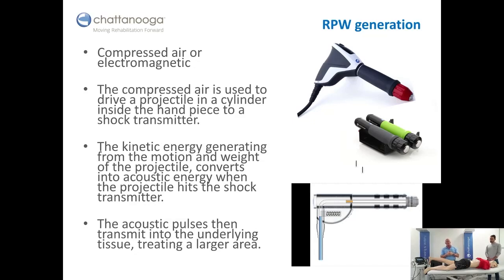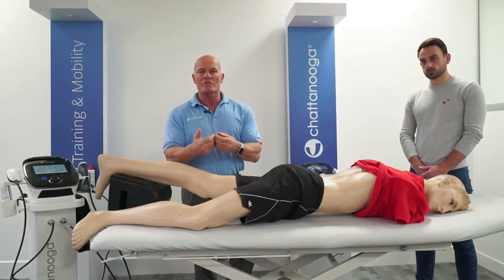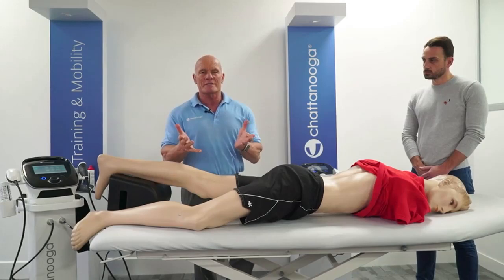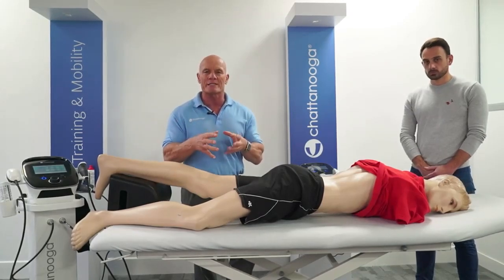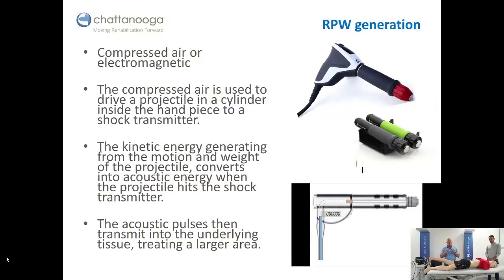And I've also contacted the manufacturers because I wanted to know what the energy value is that's coming out of their handpieces. Because after all, this is the most important thing, because this is what's having an influence on my patient. Not one of these manufacturers could tell me what the energy values were coming out of their machines. So we're going to stick with compressed air technology.